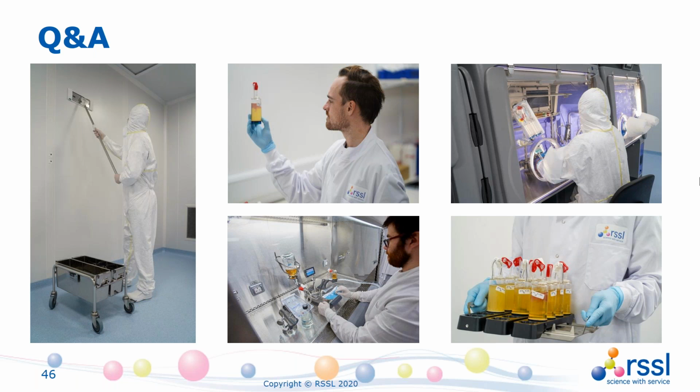And especially, the worst things I've seen are albumin based products, be they from human or animal origin, and they can foam quite excessively, so you kind of really sometimes get into a region of like quarter pump speed. And again, ideally, going back to the point I said some point in the presentation, you should really establish the pump speed or range of pump speed during the method suitability testing and ensure that goes into the SOP. And you really should have a list of different products and different pump speeds that are suitable for those different products. That will help to avoid things like foaming, and then foaming can lead to filters blocking, etc. So it's best to avoid that.